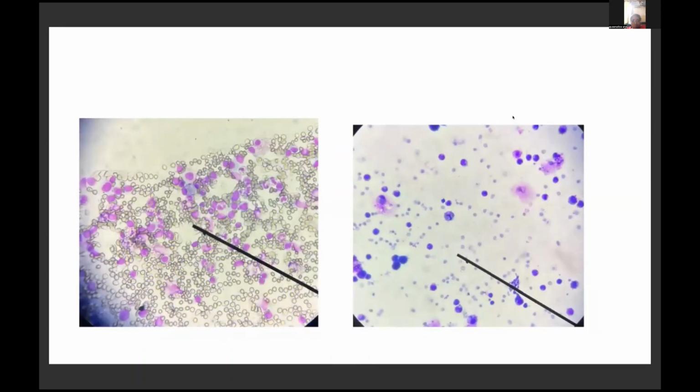Again, in the left panel, you see there's still presence of blasts in a marrow which has already been treated. So I'll take it as treatment failure. On the right side, you see some very round cells in a marrow which looks very hemodiluted. Actually, these were hematogones, these were not blasts. An amateur person might think that both are blasts and label it as relapse. So you should know that there's something called hematogones coming in post chemo marrows. Next slide.